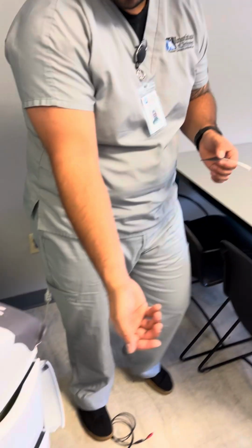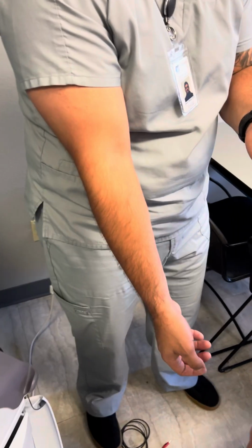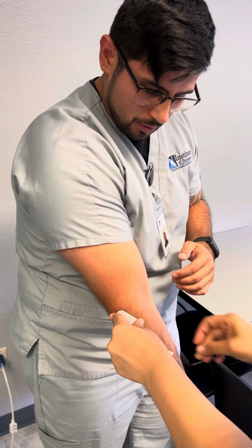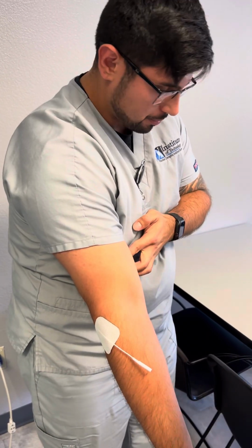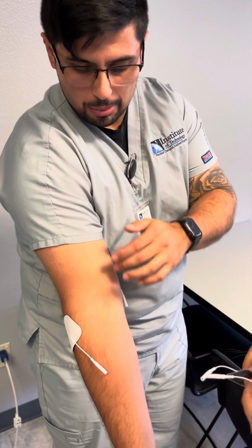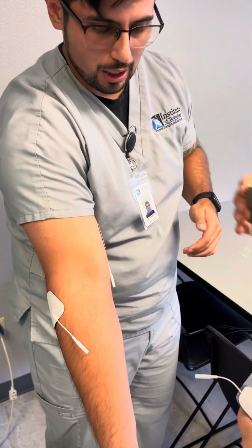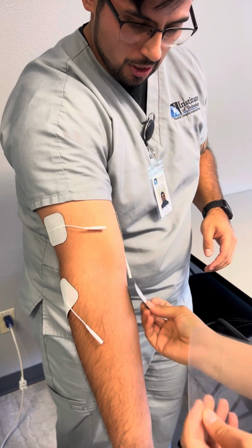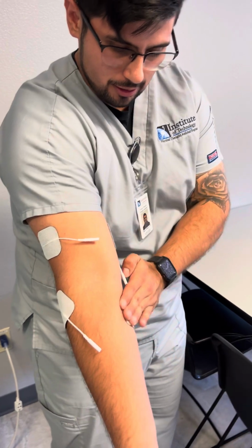So we have a guest, surprise guest. We're gonna place these in a crisscross. We're gonna put one here, and then the other one here. And you want it to be in the center area of pain. So for example, we're gonna put the elbow as the area of pain, and then it's over here. Cool. All right. Thank you, Andrea.